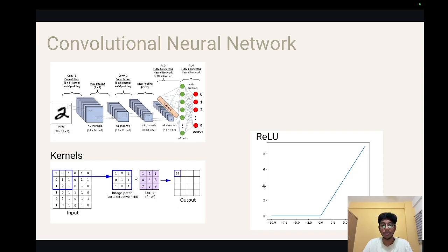The feature map is then passed through the ReLU activation function. The use of ReLU is that it allows the convolution layer to extract complex features from the data by introducing non-linearity between convolution layers.